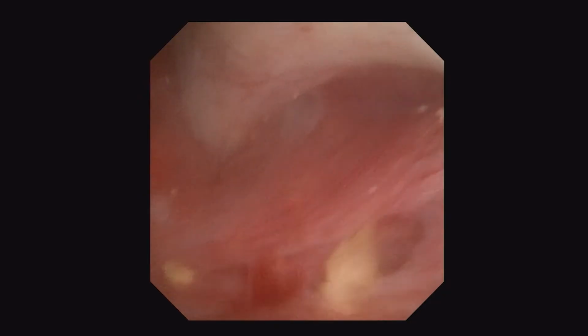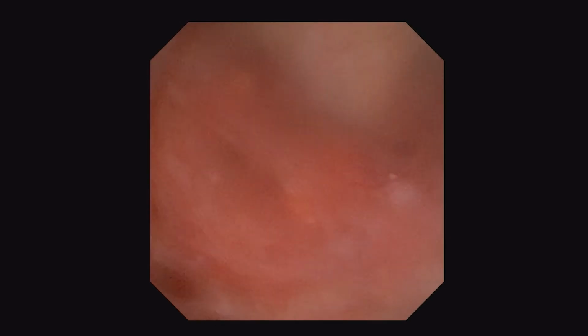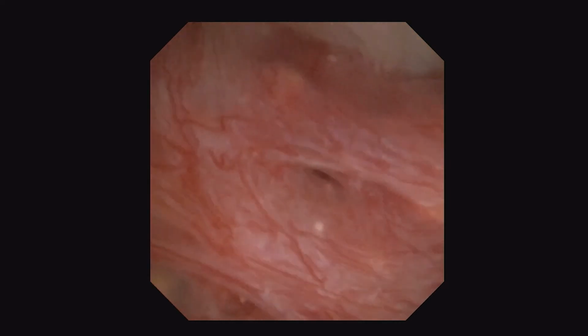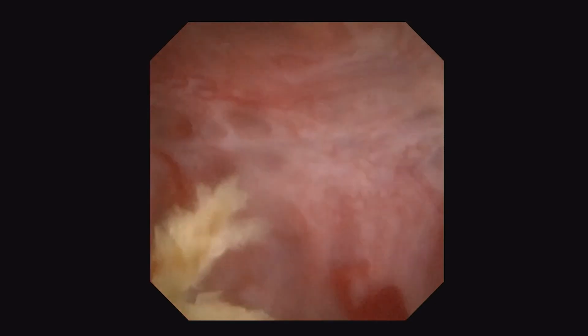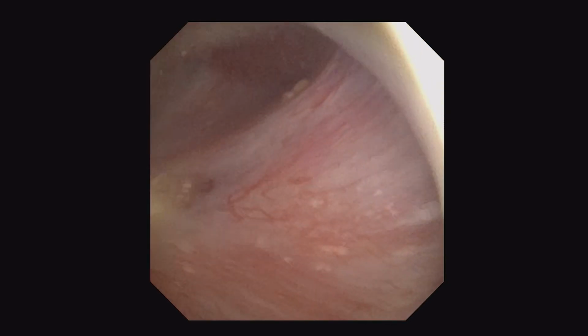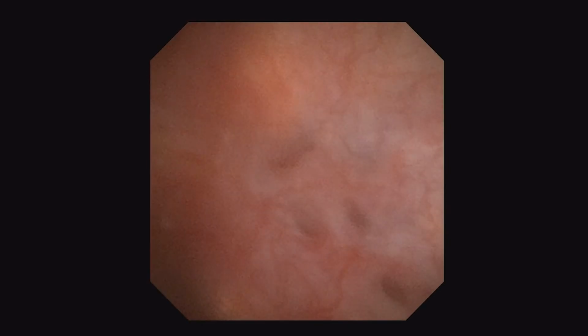Ductal plugs, on the other hand, tend to be more expression of disease. You tend to see a lot more mineralization underneath the surface of the papilla, and commonly you'll see these dilated ducts. And these are actually the ducts of Bellini, and upstream from here, where urine and fluid used to be filtered, the ducts have been occluded by mineral deposition, and you actually see stretching of the duct distally, and so that tends to go along with ductal plugging. We don't typically see that in most patients.